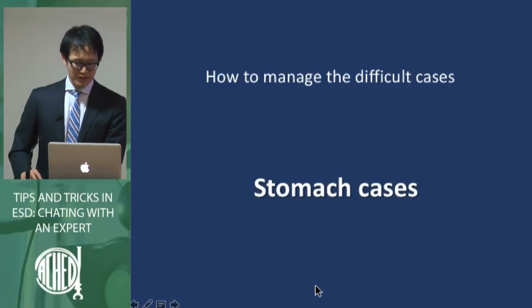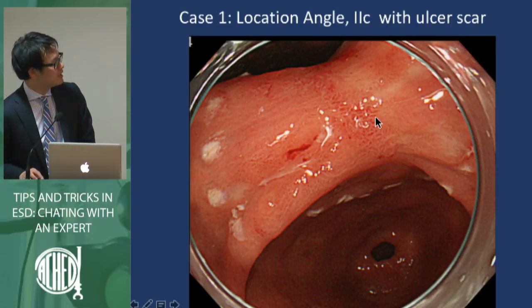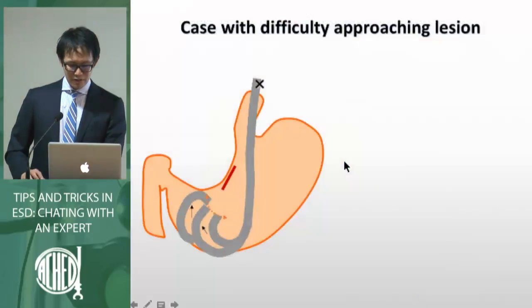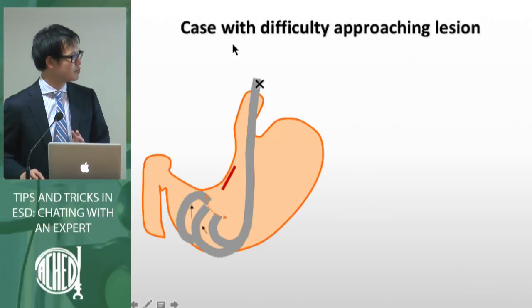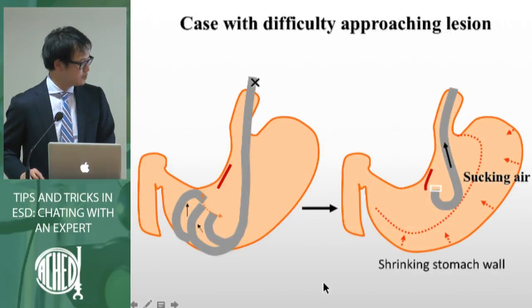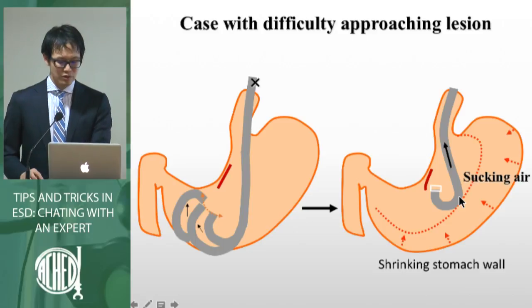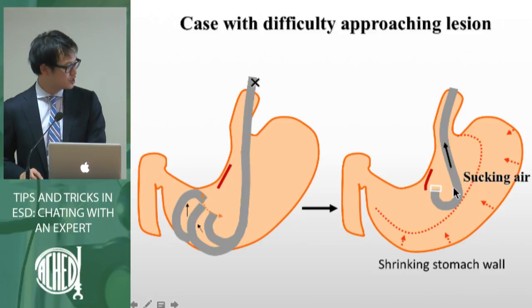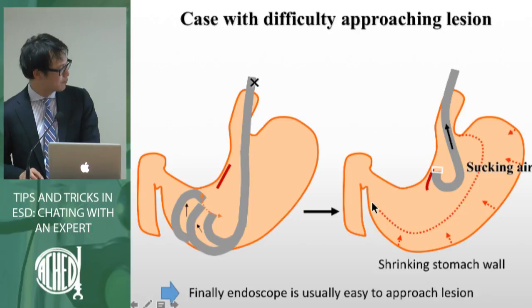So I would like to show the difficult cases. This region is the lesser curvature, the angle of the lesser curvature. It has ulcer scars. So this is very difficult to approach. Initially we are sucking air, and then the stomach shrinks its wall, so it's easier to approach the region. So this is the initial way to approach the lesion.